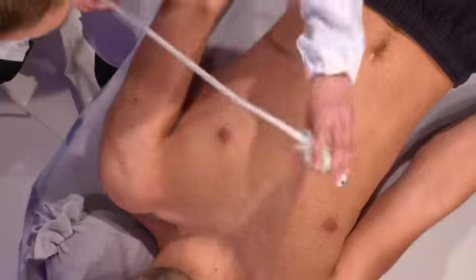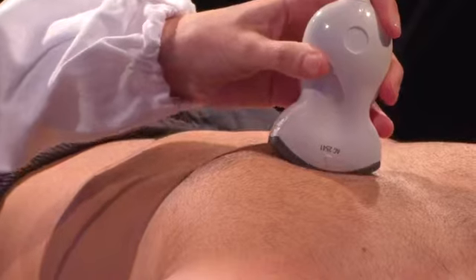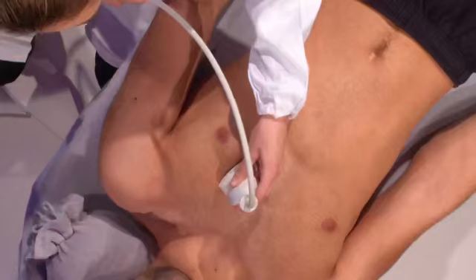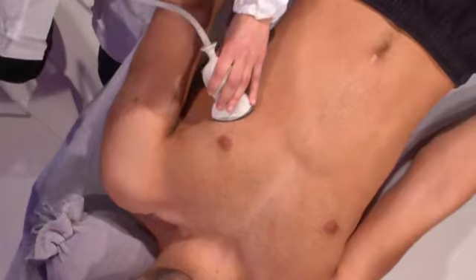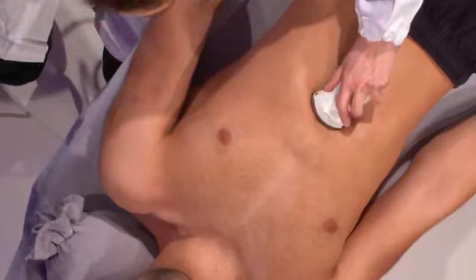If your patient is in cardiac arrest, the FEEL protocol can be integrated directly into advanced life support by quickly scanning the parasternal long axis view, like this, and then the parasternal short axis view, like this, then moving to the apical four-chamber view, like this, and to the subcostal view.